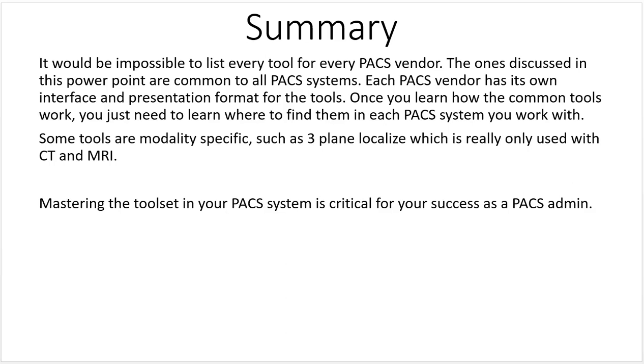Mastering the tool set in your PACS system is critical for your success as a PACS admin. You will be absolutely loved by your radiologist if you have an expert understanding of the tool set and you can show them how to apply the tool set quickly and correctly to help them with their job.